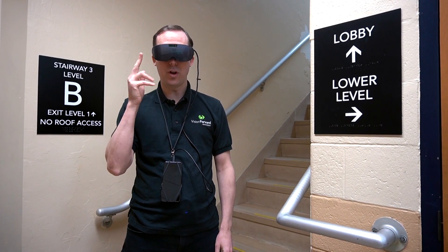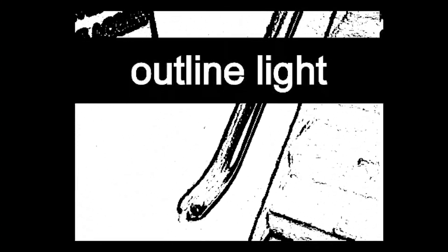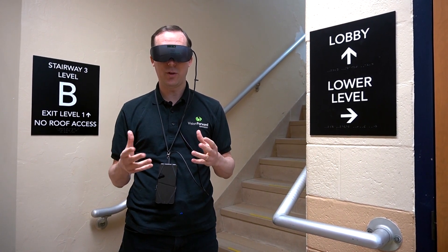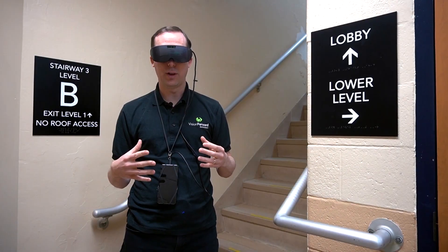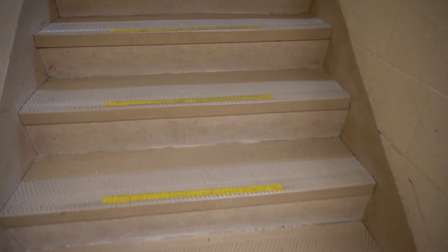Here we are in the stairwell to take a look at one of the other new modes — the outline mode. What this does is put bold outlines around objects that you're looking at. There are three different colors to choose from: a regular color, white, and dark. Either will make things stand out because of the bold outlines — kind of like looking at a cartoon with really bold black lines around everything. You can also adjust the sensitivity of how those dark lines are created around objects, and you can change the thickness of the lines. I'm going to use the outline mode to identify the outline of the stairs and walk up them safely.